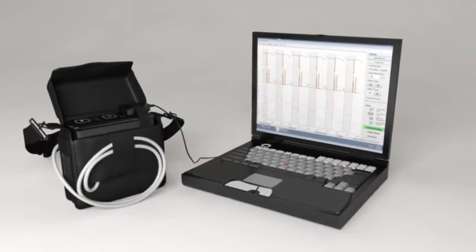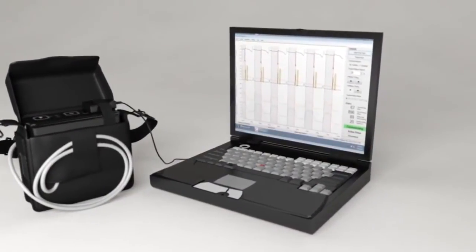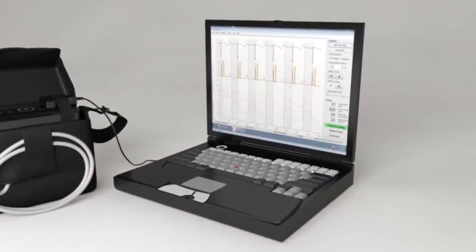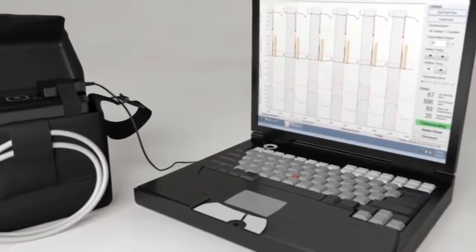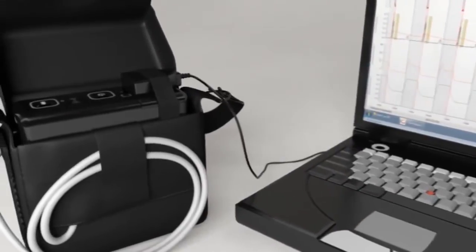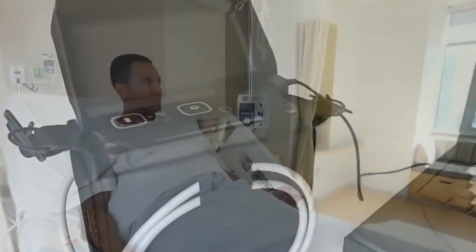A dedicated C-Pulse programmer is used to adjust timing settings in order to have the balloon inflated after the LV ejection and the closing of the aortic valve. It is also used to ensure the balloon deflates prior to the start of LV ejection.